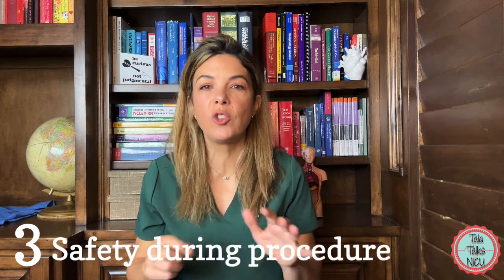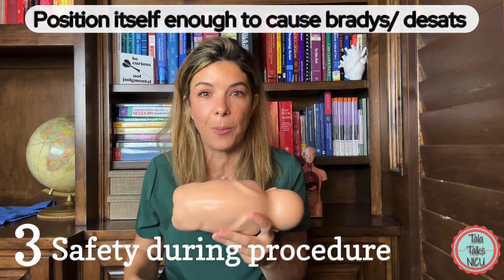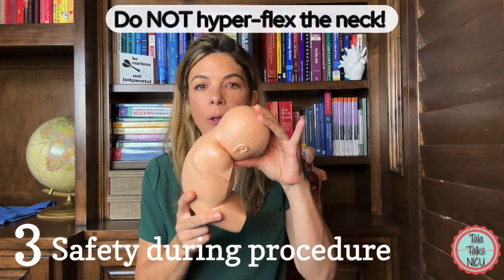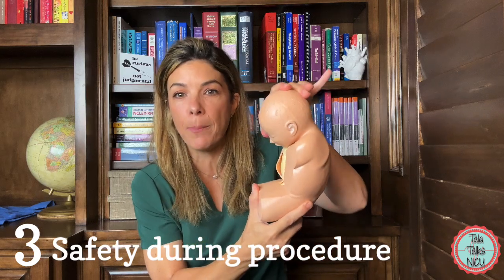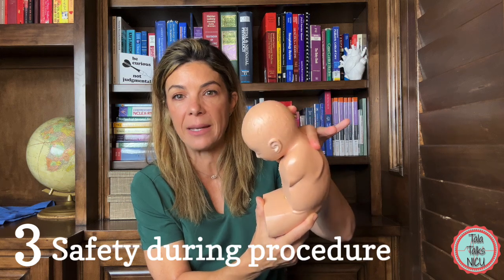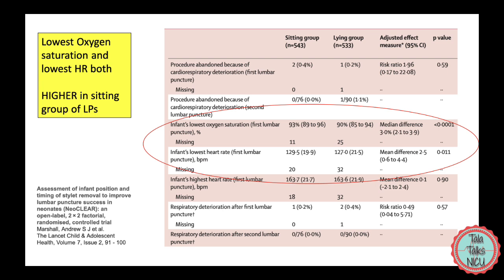Even if the baby is super stable, they need to be monitored carefully during the tap. Sometimes just placing them in this position is enough to cause bradycardia and desaturations. What babies hate most is excessive flexion at the neck — this causes really bad bradys and desats. What matters more is that the actual back is bent, not the neck. Hyperflexing the neck doesn't help open up the back at all. There is some data that babies have fewer events in the sitting-up position, probably because we're less inclined to flex the neck.